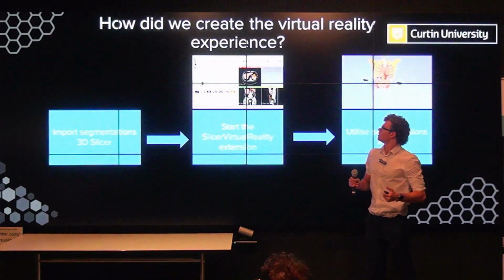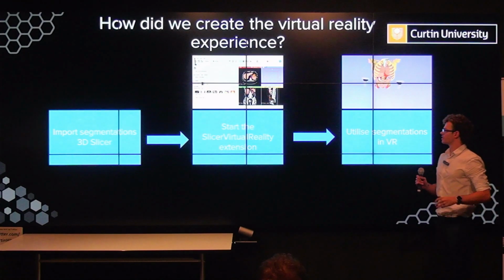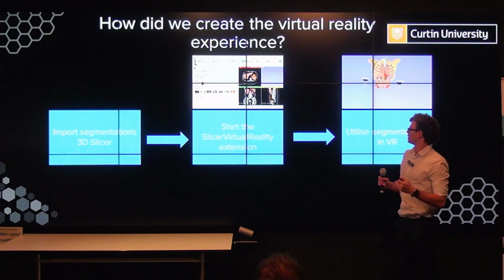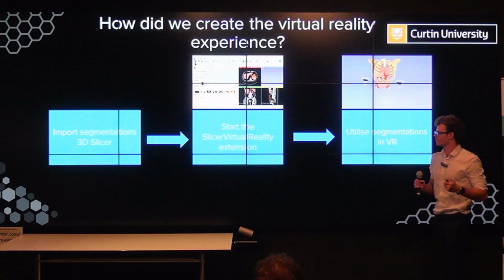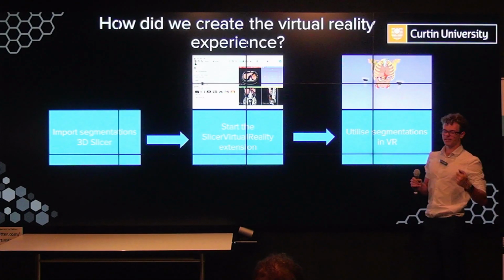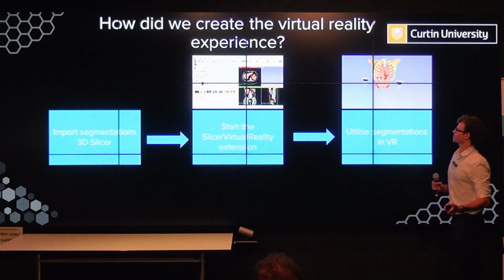So now we have our two cases. We then import them into 3D Slicer. We use the Slicer virtual reality extension, an older version of 3D Slicer, by the way. Using an Oculus Quest 2 and Steam VR, we can play around with them in virtual reality.